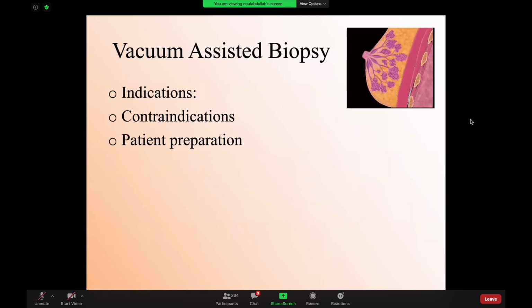What is a vacuum-assisted biopsy? For the R4 preparing for the exam, you have to know the indication for vacuum-assisted biopsy. The commonest indication for vacuum-assisted biopsy is if you have a complex cystic lesion. If you have a complex cystic lesion, I don't do a core biopsy. I do a vacuum-assisted biopsy. The idea is you want to take as much as you can and remove that complex cystic lesion. You can use it as well in cases where you've done a core biopsy of a lesion and the biopsy result is discordant with the finding that you've seen.